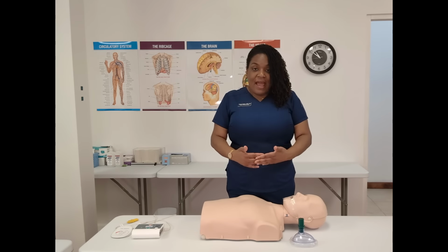After 30 compressions, we're then going to utilize our pocket mask, which is more like a teardrop shape. The angle of the mask goes over the victim's nose. We're going to press, and then we're going to open up the airway with a head tilt chin lift technique. So let's repeat that. Pocket mask, angle portion, bridge of the nose, press, tilt, and now you're going to give a breath. Repeat it and follow it by a second breath. So after 30 compressions, you give 2 breaths. Each breath should last about 1 second.